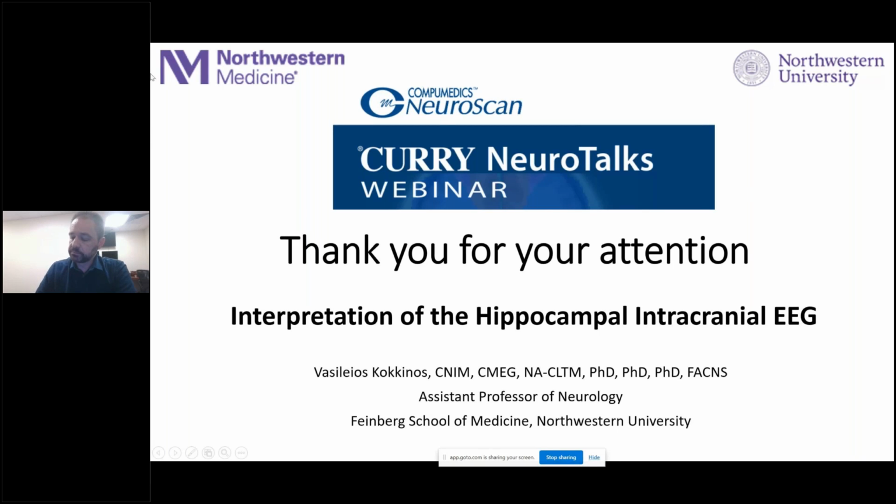We have a few. We have about four. I'm just going to start with the next one. Have you looked at patients with RNS to bilateral hippocampi and described what is related to absence of seizures? Do they have barks and spindles? Because a lot of patients have bilateral temporal epilepsy or epileptiform abnormalities, and this is asked by John Eden.